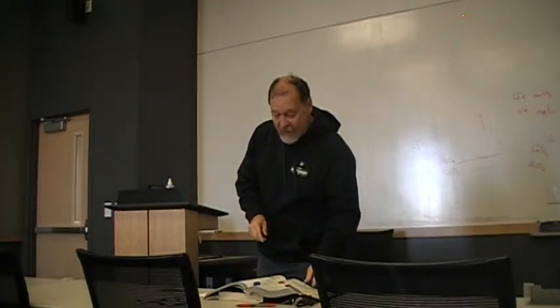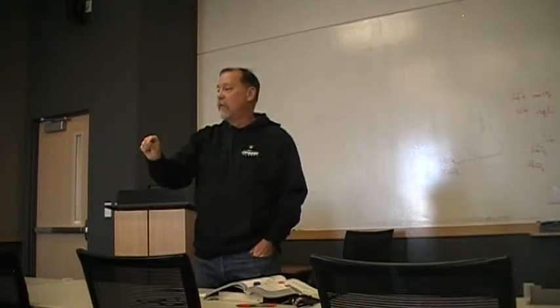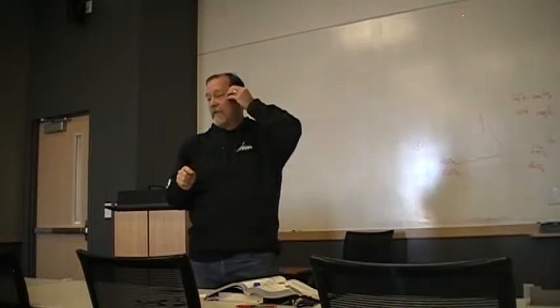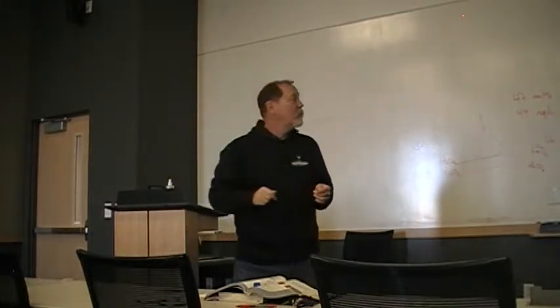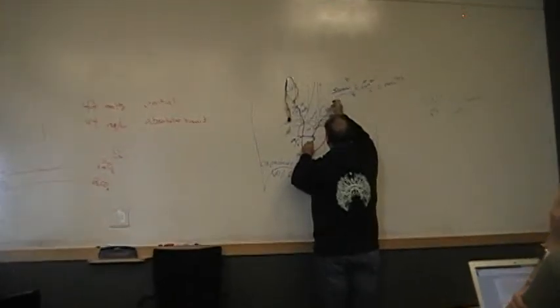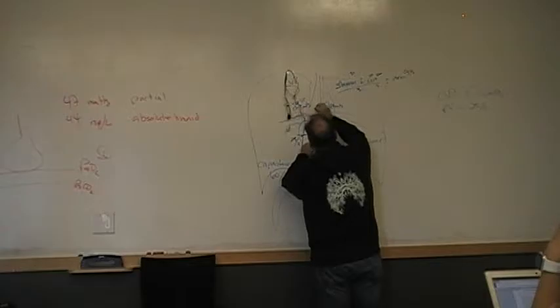So, in the next segment then, what happens when the pressure goes to 25 and now it's going down to around 12? What's that a visual representation of, where that catheter is in the heart? Yeah. So now it's gone past this pulmonic valve. It's gone all the way past this pulmonic valve, and it's sitting in the pulmonary artery.